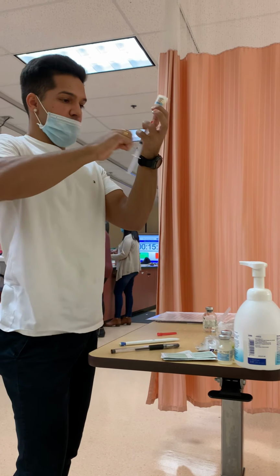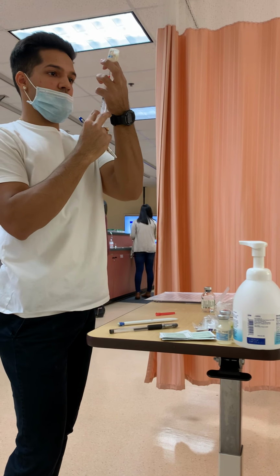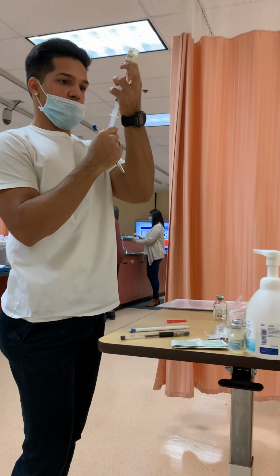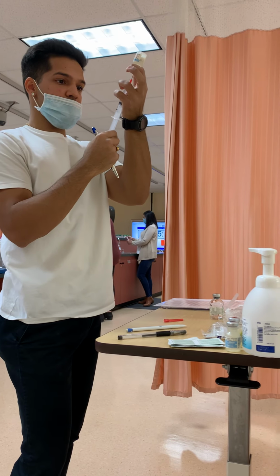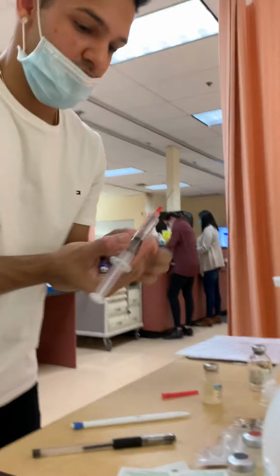I'm just going to be getting rid of all the bubbles. Over here I have 6.8 mLs, which is my correct volume for my sterile water.